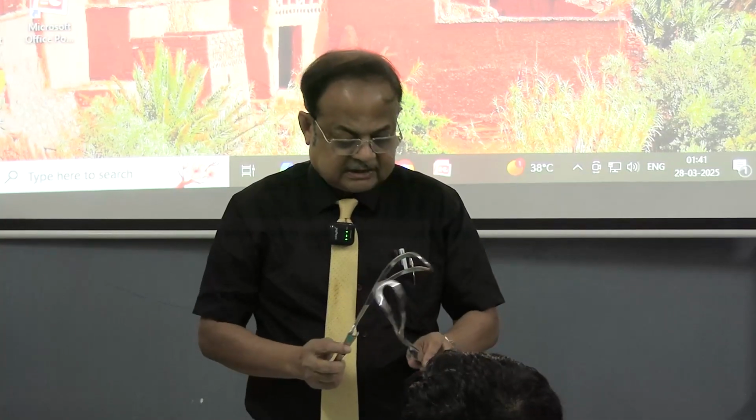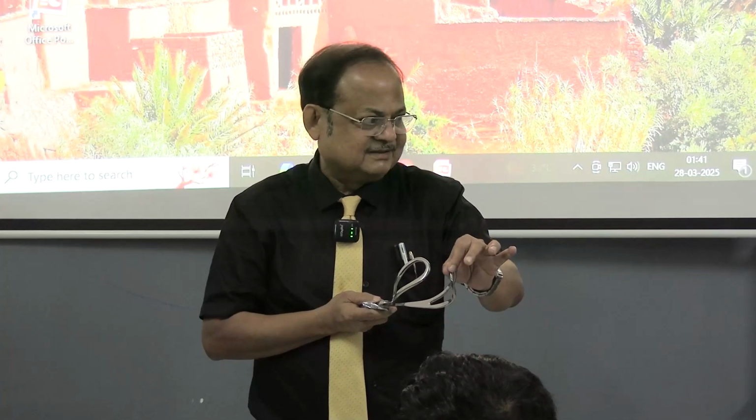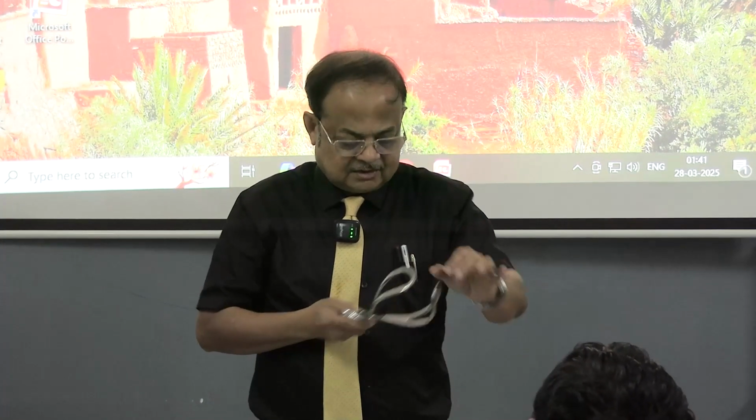And when you articulate this forceps like this, there is a gap. This length is 2.5 centimeters, because when you apply it, the neck may be trapped. The occipitomental diameter, the neck may be trapped, so that is the gap.